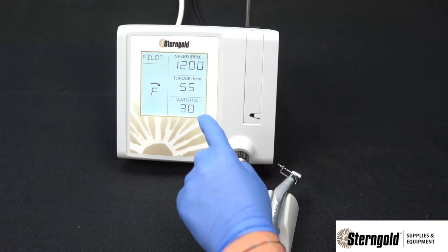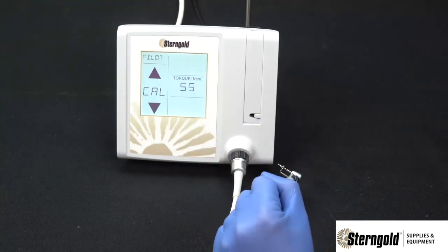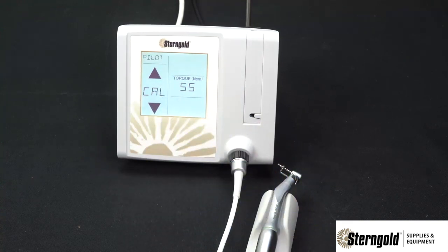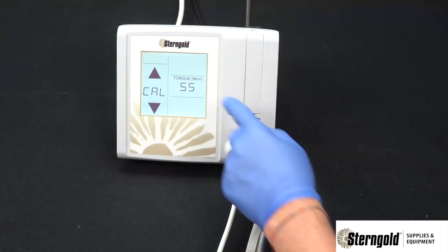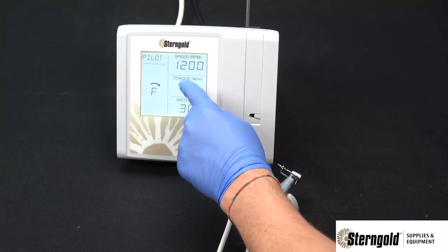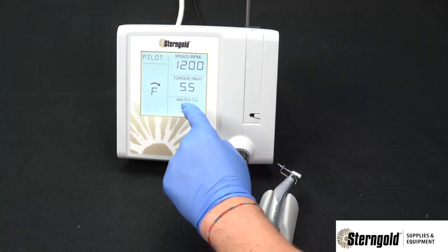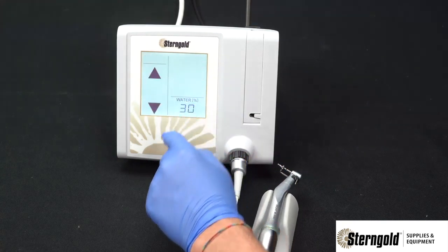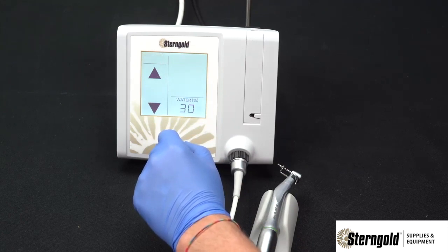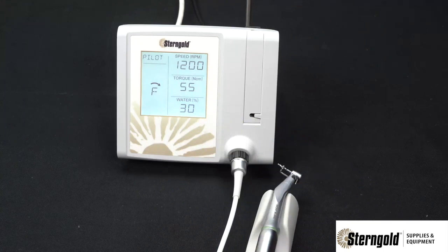To adjust the torque, press the torque section of the operating screen to enter the torque adjustment screen. Use the up and down arrows to increase or decrease torque, then simply press the torque section again to return. To adjust the water flow to the handpiece, press the water section of the operating screen. Use the arrows to increase or decrease the water supply, then press the water section again to return to the operating screen.